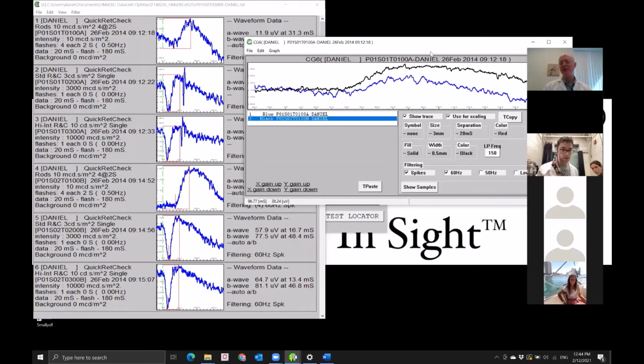Now, in different types of flash in different scenarios, we're able to tease out different cellular contributions to those waveforms. That is one of the things I want to make sure is made clear in our conversations at the Q&A session, so that when you're deciding what protocols, what type of electrophysiology you need to conduct to best support your research, you've got a good sense of that by the end of this course.